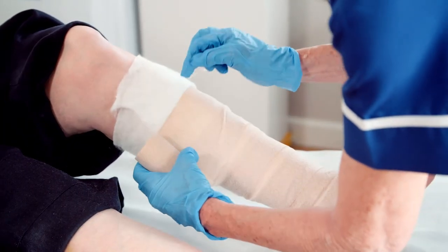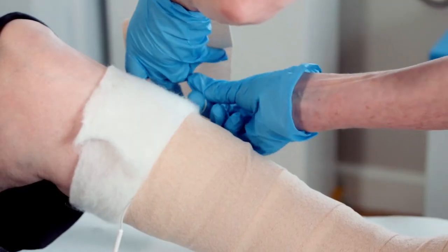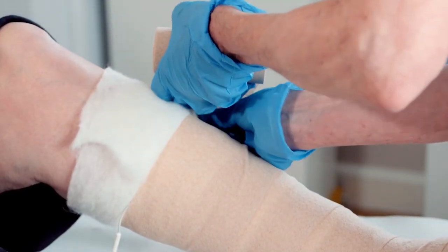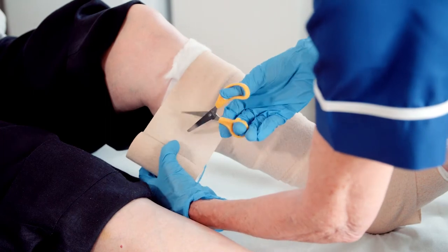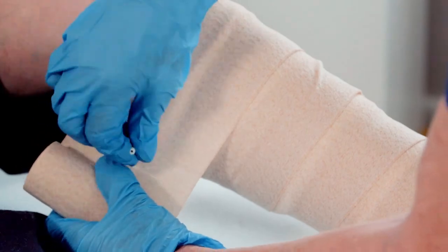You are now ready to apply compression bandages. Follow the manufacturer instructions for applying the compression bandages, ensuring that the electrode wires are fed through the compression bandage and not in direct contact with the skin to avoid any pressure injuries.